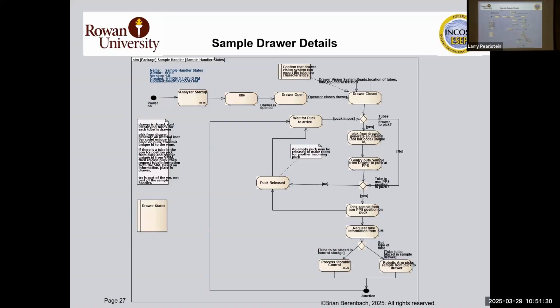So one of the analysis stations can go out, and the others will just keep on cranking. Okay. And sometimes if it's a very high volume day, and you want to do 4,000 samples, you might have more than one analysis station doing the same thing. Okay, so you can do it in parallel.